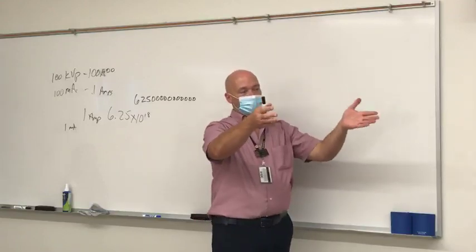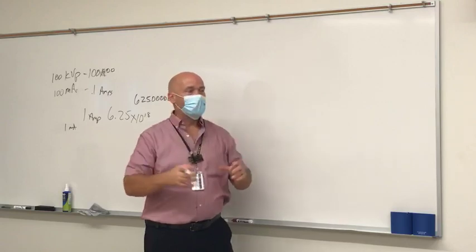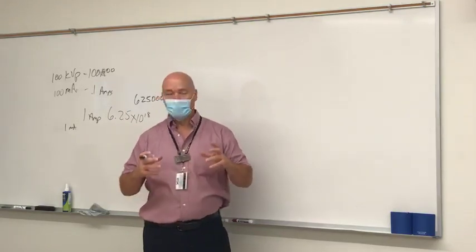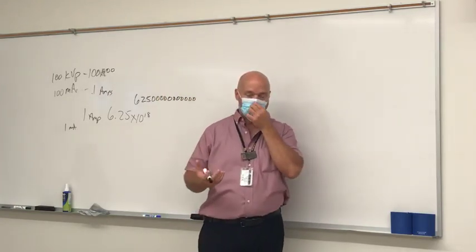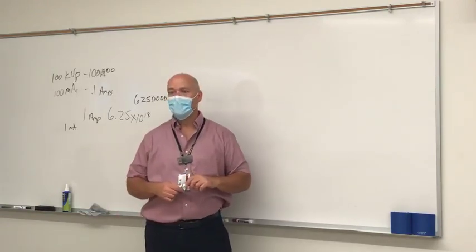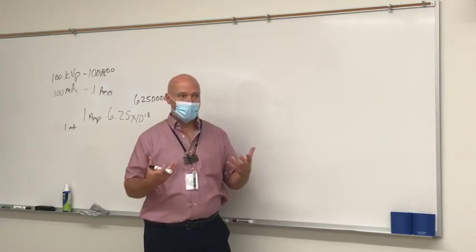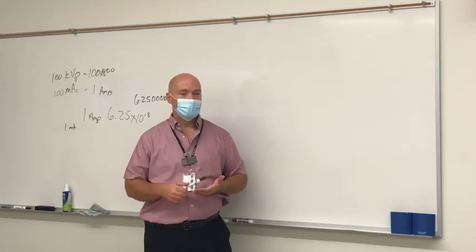So incidentally, the difference between those two is that one had the metal housing around it, and the other one did not. The purpose for that metal housing is actually to remove some of the heat. The reason it's heavier is because it's got oil inside of it, and the purpose of the oil is to remove some of the heat and extend the life of the tube. We'll talk about that this semester as well. We do have metal X-ray tubes, which is really kind of weird, but that one is just a cooling mechanism for the X-ray tube. That's the difference between the two.